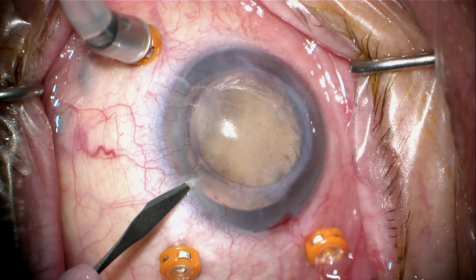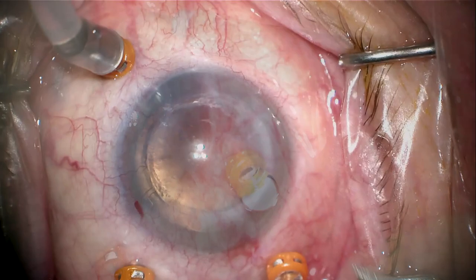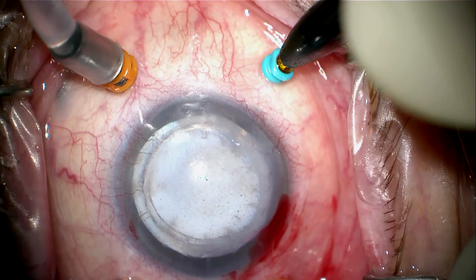We're going to go ahead and place pars plana trocars — these are 23-gauge trocars — and make some paracentesis. This patient had a previous retinal detachment years ago treated with a buckle, but has not been vitrectomized. We're putting in our chandelier light now and making a peripheral clear cornea incision. The view through this cornea is not fantastic, but we can see well enough to do the pars plana vitrectomy.